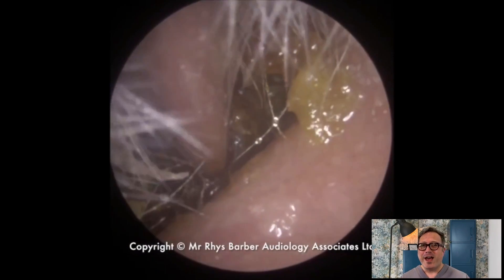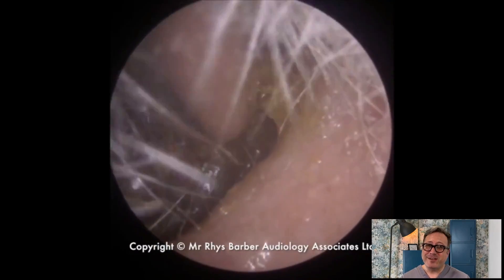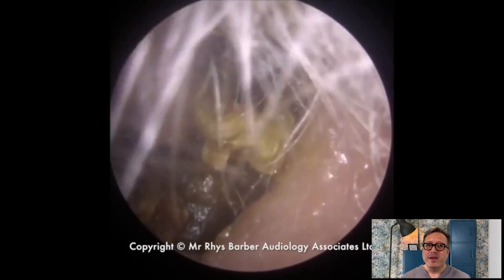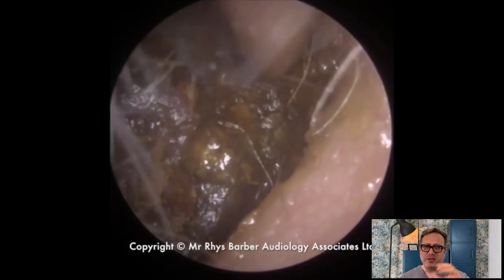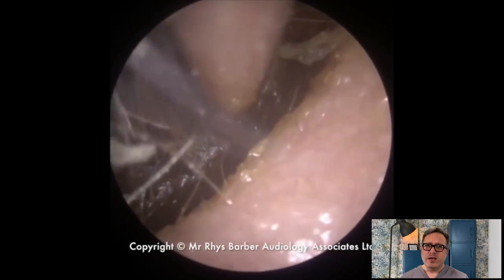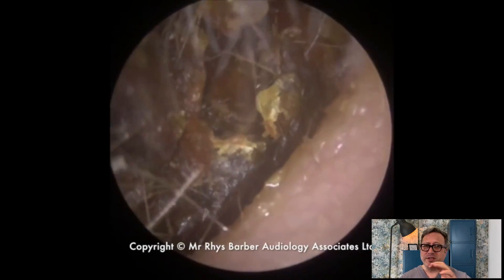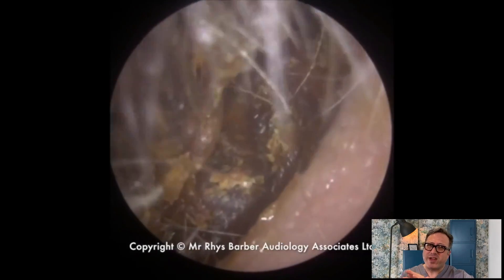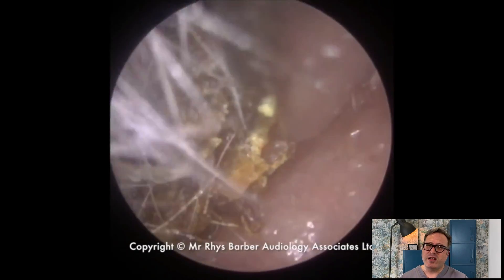This particular patient has some very, very dry earwax. This is one of the earlier videos that we did, so it's been a little while since I've seen this — the first time I've watched this video for a while. You can see we've got the standard size Zolna tube in here, just slowly working this kind of dry skin, dry wax away from the right hand canal wall. This wax is a really tough plug — it's really hard because as you're passing the Zolna tube over the top it's just breaking tiny little pieces away and they're getting sucked into the machine.